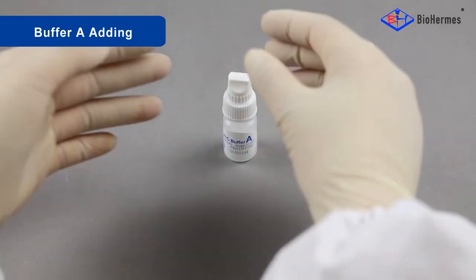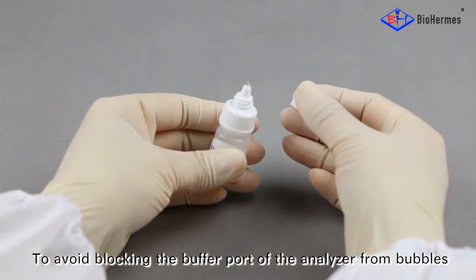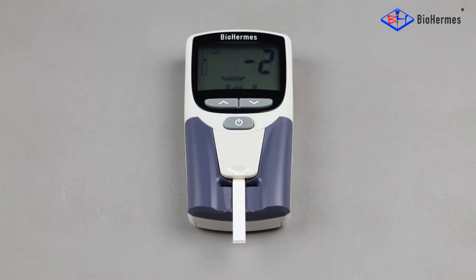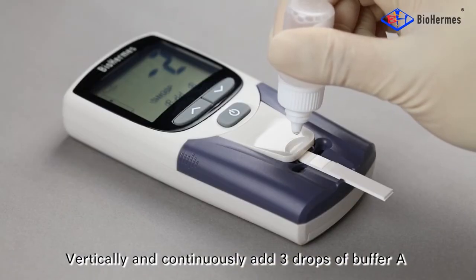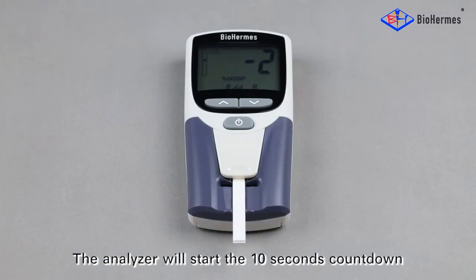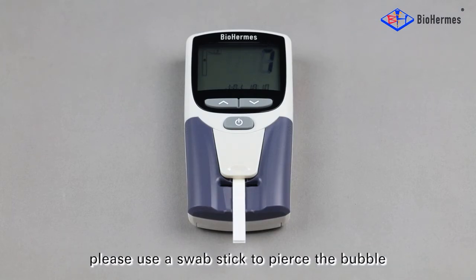Buffer A adding: unscrew the upper cap of the buffer vial to open it. To avoid blocking the buffer port of the analyzer from bubbles, squeeze the bubbles out and then wipe them with the cap. Vertically and continuously add 3 drops of buffer A to the buffer port after the voice prompt. The analyzer will start the 10-second countdown. Note: if a bubble blocks the buffer port, please use a swab stick to pierce the bubble.